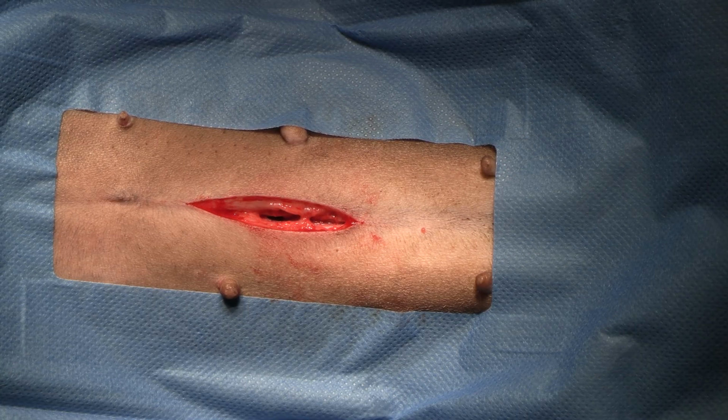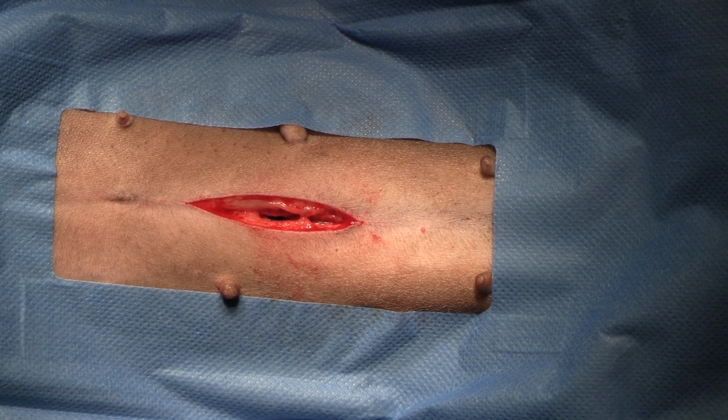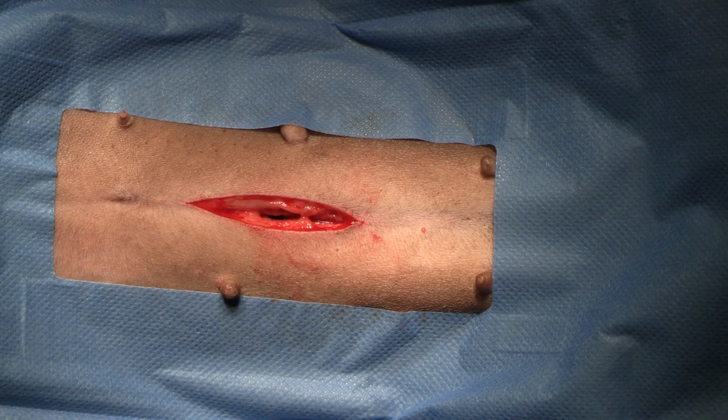Now closure is just routine. I'm going to use 3-0 Monosyn for the linea alba, simple continuous, and then I'll use some 4-0 on the subcuticular intradermal layer.